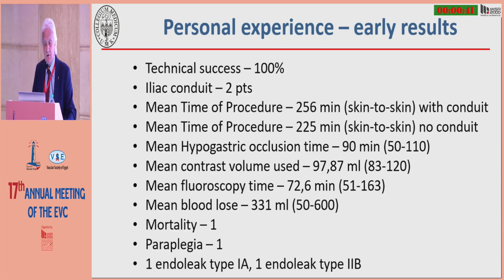What is the personal experience? The technical success was 100%. We used the iliac conduit in 2 cases. Look at the mean time of the procedure. Skin to skin with conduit is 256 minutes, and without conduit 225. And the important part of this is the mean hypogastric occlusion time, which was 90 minutes. So it means 1 hour and a half. It is a long time.